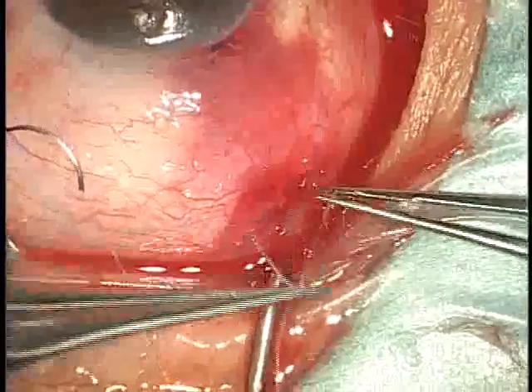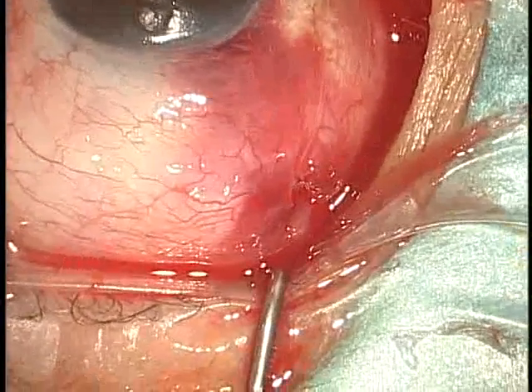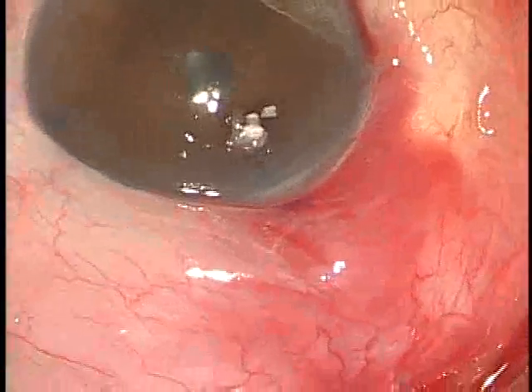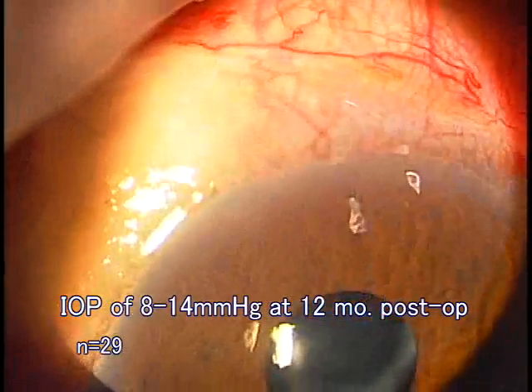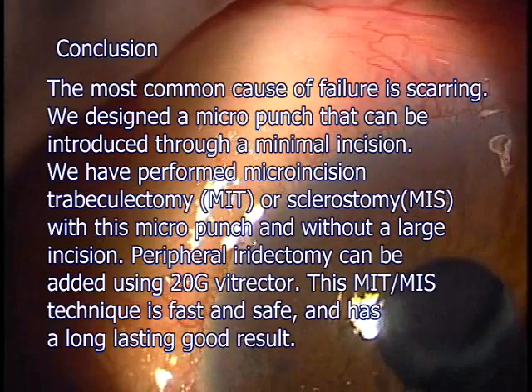Standard trabeculectomy closure must be very meticulous to prevent wound leak that could lead to loss of the bleb and a flat anterior chamber. The micro incision trabeculectomy offers an ideal closure. You can see a good peripheral iridectomy and a large, smooth, functioning filtration bleb. Slit-lamp examination shows a good filtration bleb postoperatively. With three-mirror examination, the trabeculectomy window was well open internally at one-year post-op. In 29 cases, the postoperative IOP was 8 to 14 mmHg without medication at 12-month follow-up.